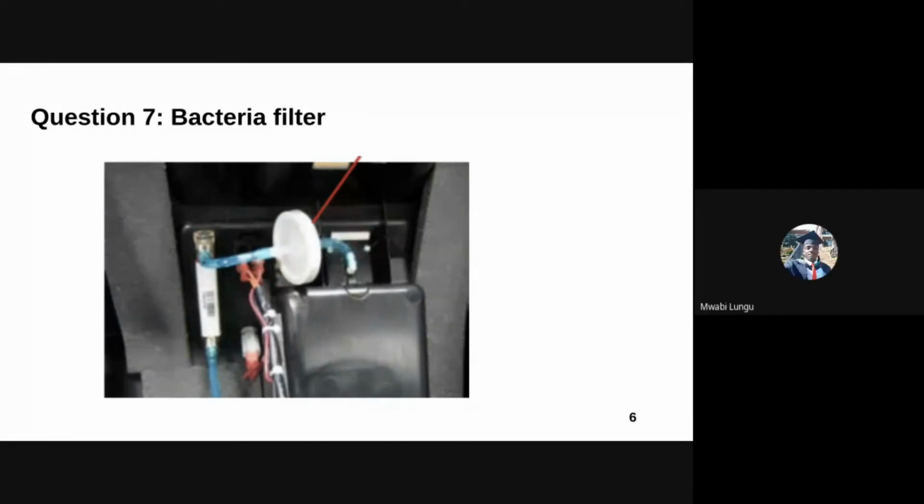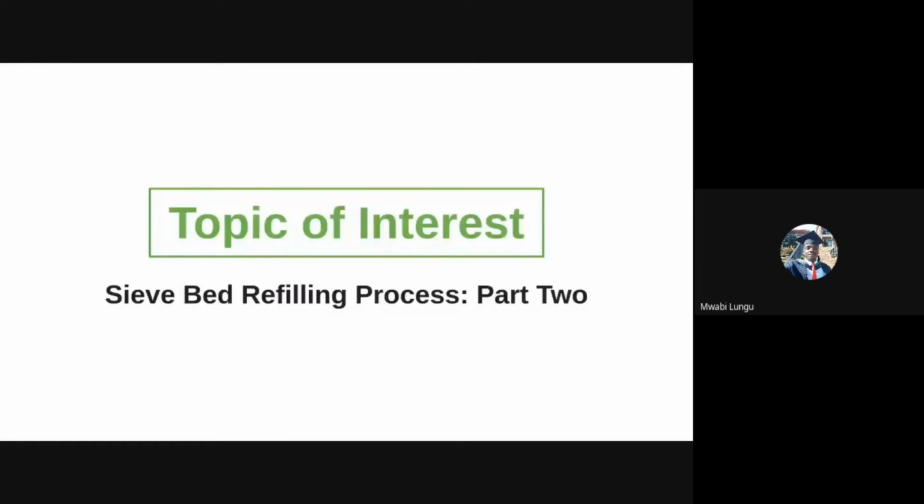Thank you very much, Cynthia, for that explanation. So I see we have some comments from Michael in the chat. Sorry, I missed them. So you are asking, is it safe to say that a faulty control board can also be the cause of the solenoid valve not performing as expected?